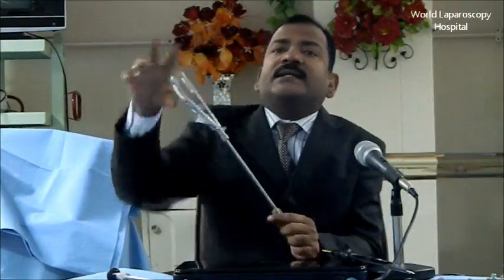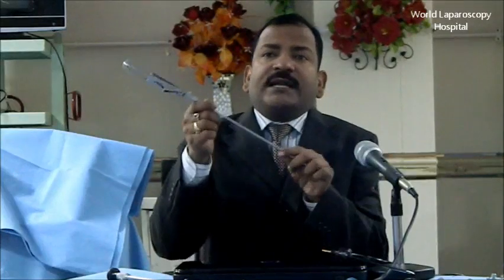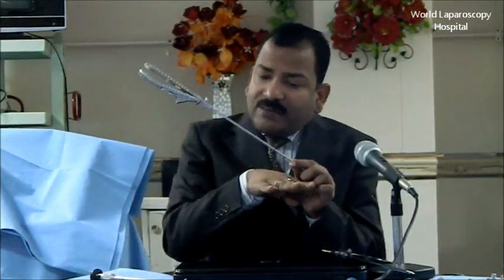But the basic principle of the port position never varies. The basic principles of dissection, suturing, knotting, tissue approximation, tissue retrieval are the same for every specialization. So, the baseball diamond concept is ergonomics, and that's why the manipulation angle is 60 degrees. Exactly the same way, elevation angle. What is elevation angle? Elevation angle is the angle between the instrument and the body of the patient. This is elevation angle.